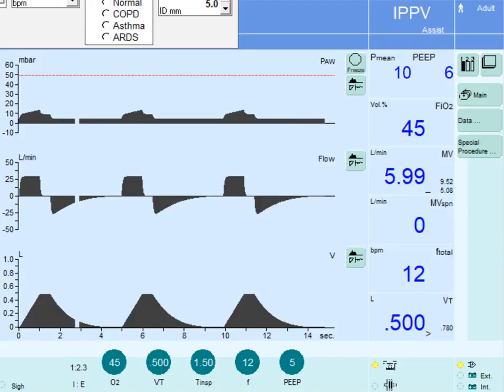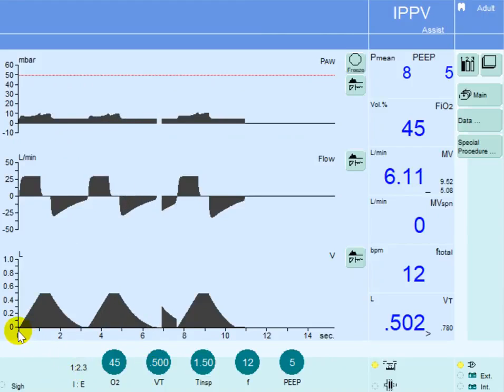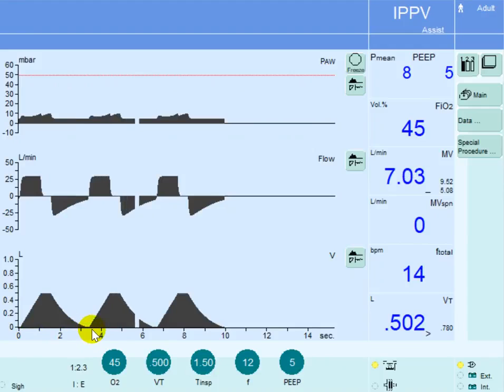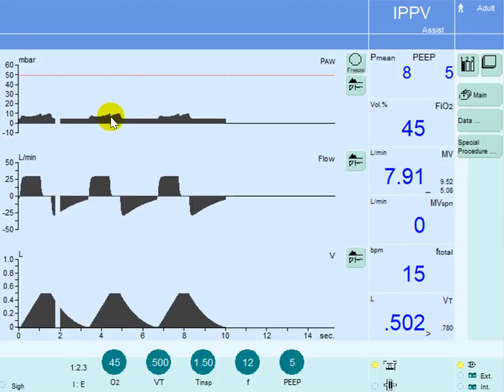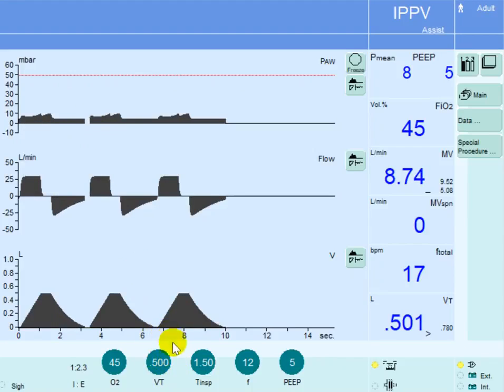Once this patient starts to breathe, every inspiratory effort will be assisted with the same control — that is, tidal volume. You can see here the patient is now breathing at a rate close to 18 per minute, so almost every three seconds there is a breath. You can notice the scaloping of the inspiratory pressure, indicating that the patient is initiating inspiratory breaths. Every time the patient triggers the ventilator, the ventilator will deliver the control, which is a tidal volume.